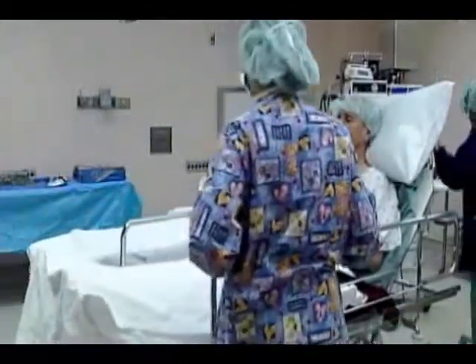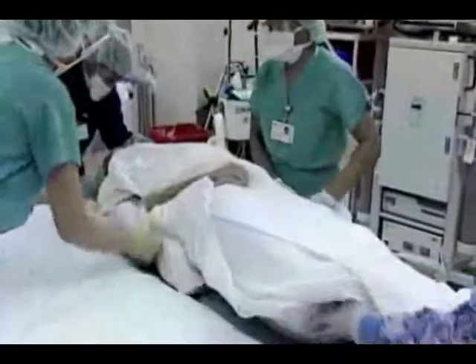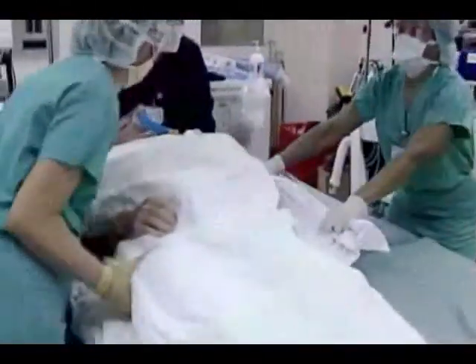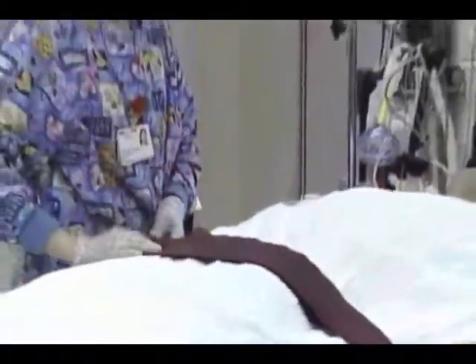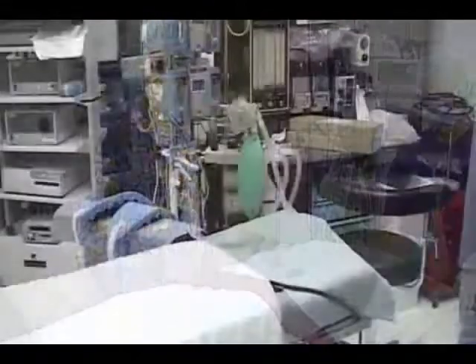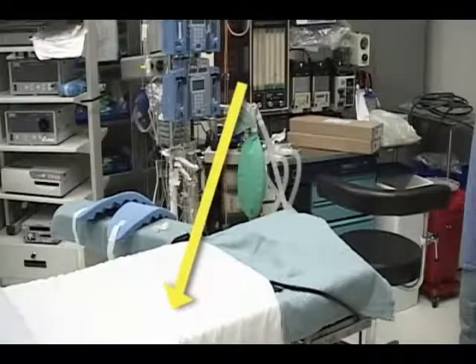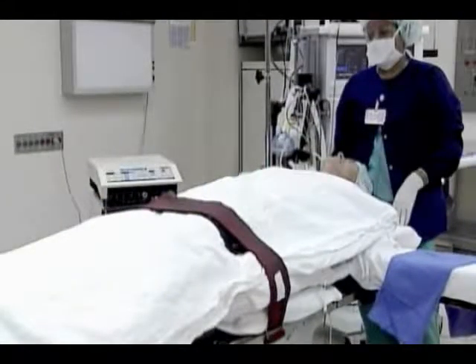Some patients need additional help. It is recommended that a minimum of 4 people be available if the patient cannot move on their own or is anesthetized. A safety strap is a reminder to the patient that the OR bed is narrow. Arm boards, a pillow, and a warm blanket help keep the patient safe and comfortable. The OR environment tends to be quite cool, so a warm blanket is appreciated.